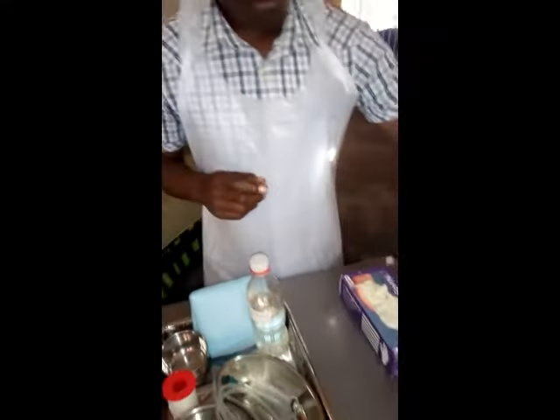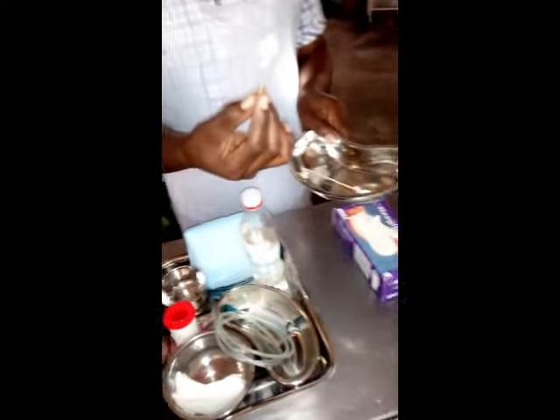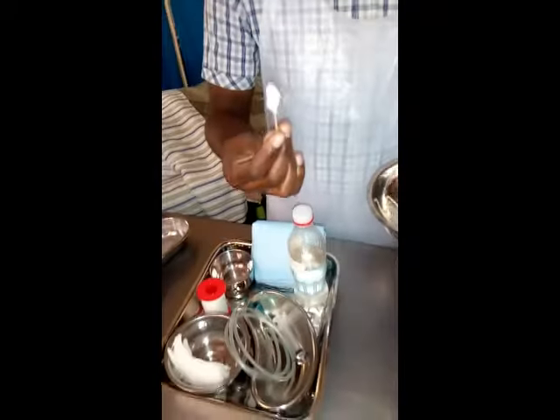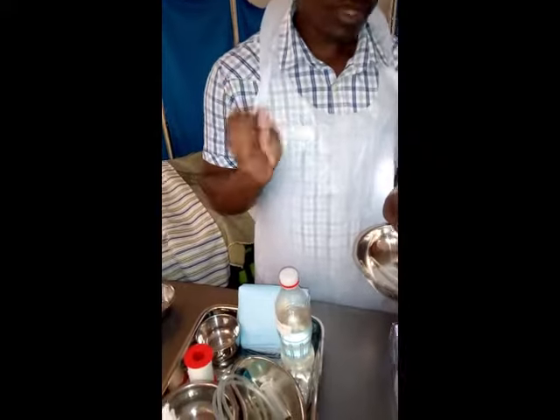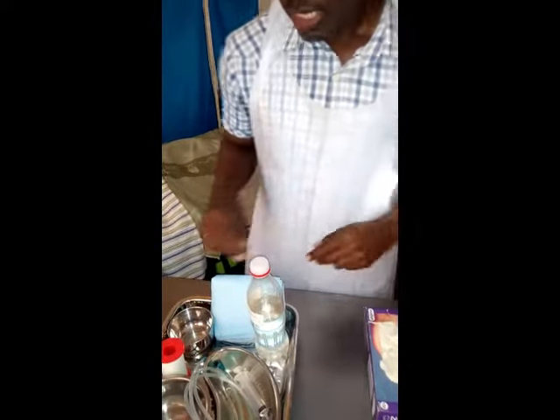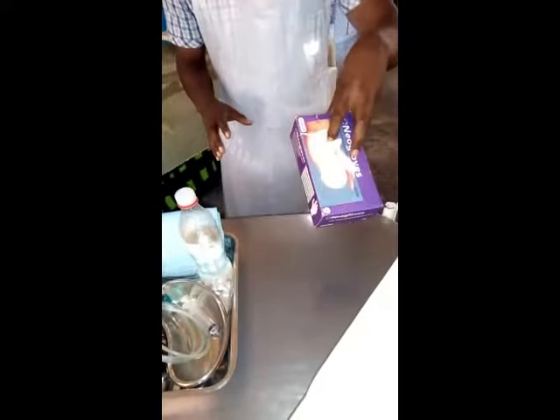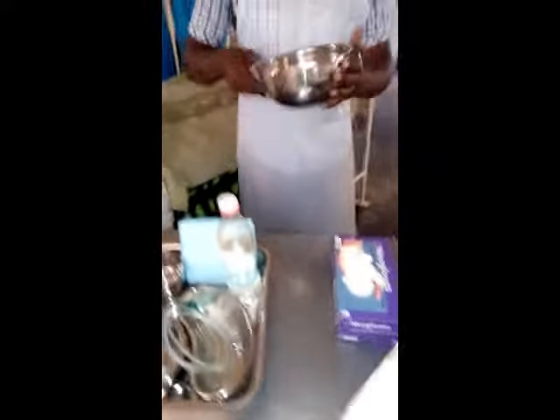Then here with me I brought orange sticks. Orange sticks are used in case a patient is unconscious to clean the nostrils. You clean the nostrils just to ensure that they are clean and patent using an orange stick. Okay. So the only thing remaining are the gloves, because you need to be gloved up as you insert this tube.